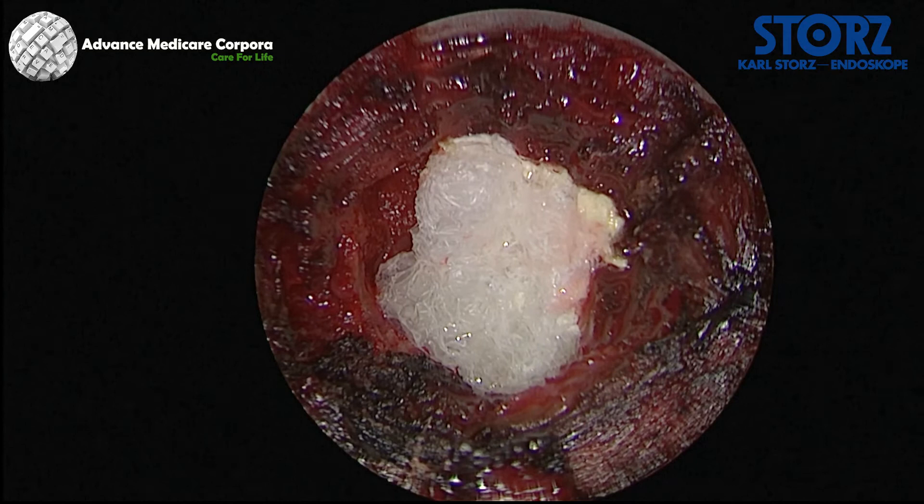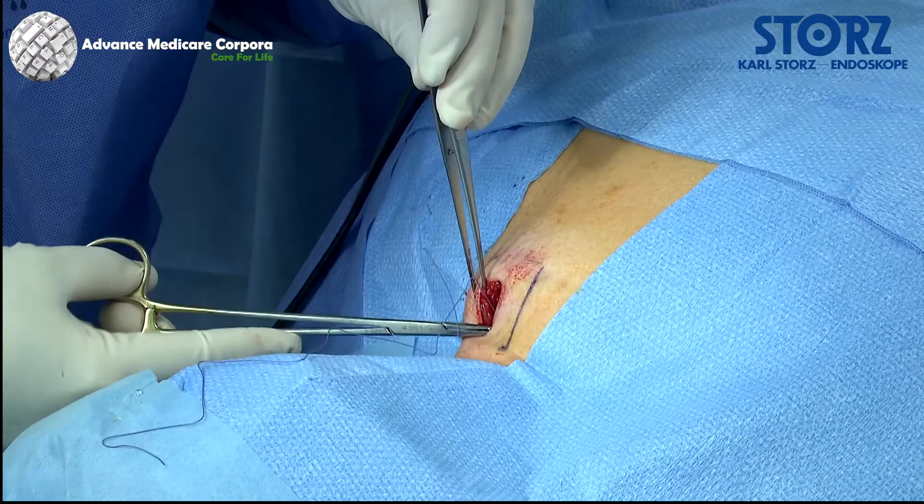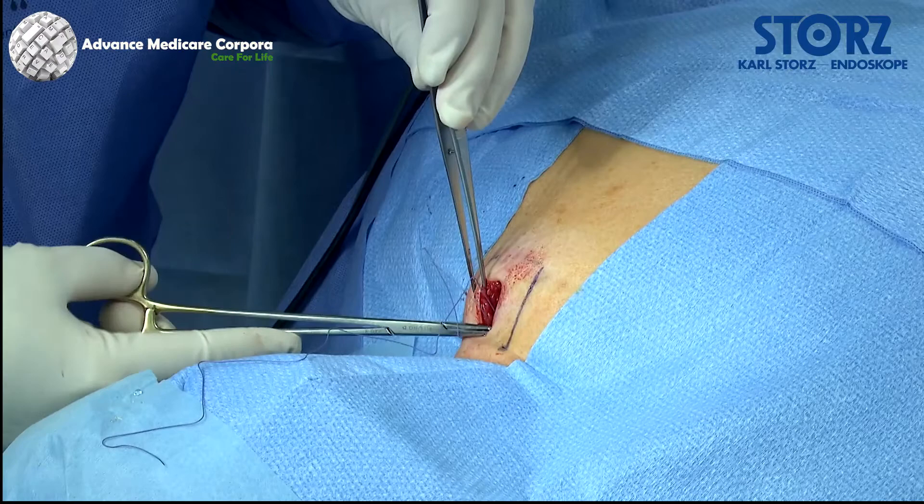Hemostasis and wound closure can be performed using a fibrin sponge. The wound is closed with a fascial suture, followed by the placement of a subcutaneous and skin suture. Decompression surgery was performed via a skin incision with a length of two centimeters.